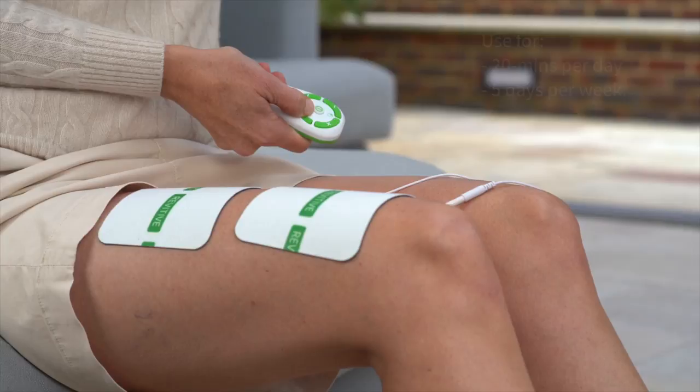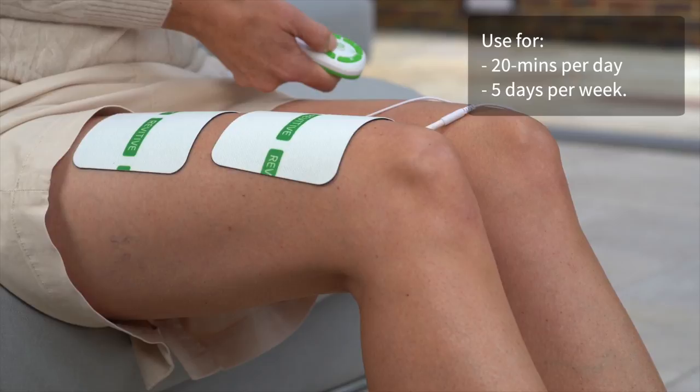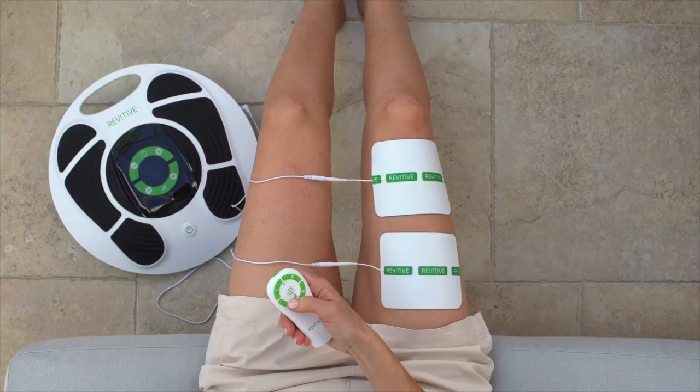We recommend using the thigh pads on the affected leg for 20 minutes, once a day, 5 days a week. Try to find a routine that works for you, perhaps using the thigh pad Monday to Friday and not on the weekend.